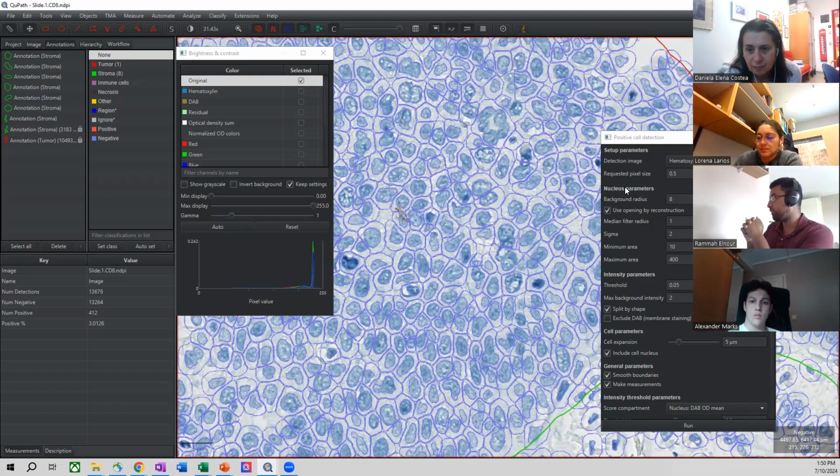If anything, like Dana said, I feel like the standard parameters work quite well. And then you look at your TMA, and if you see that something needs a small adjustment, you can adjust that specific parameter one step at a time. So one parameter at a time, basically, is what works best for me.